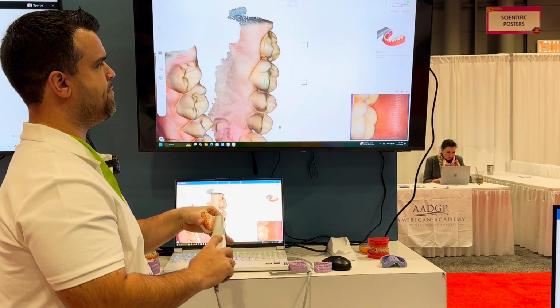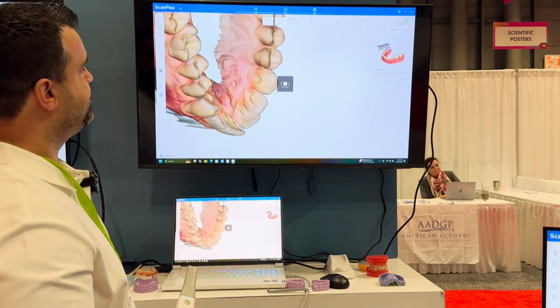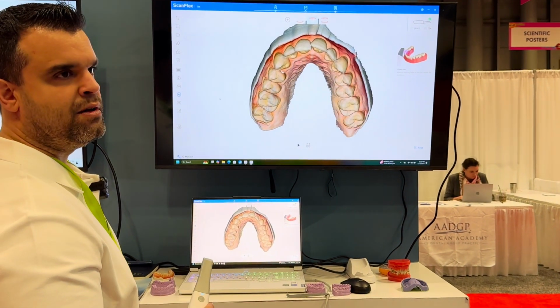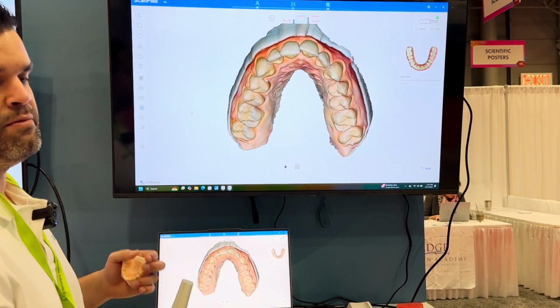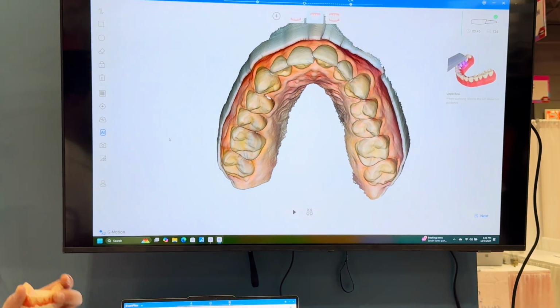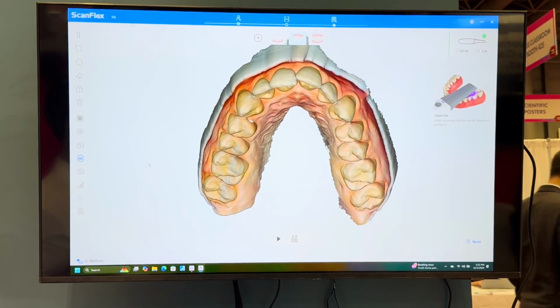Even if I capture something, the system won't allow it to stitch. So it's a very useful AI tool that we provide to the average user in order for him to be able to scan effortlessly and without any problem.